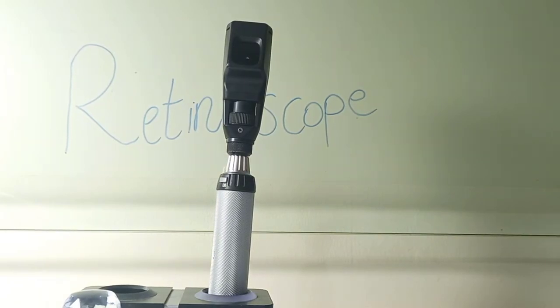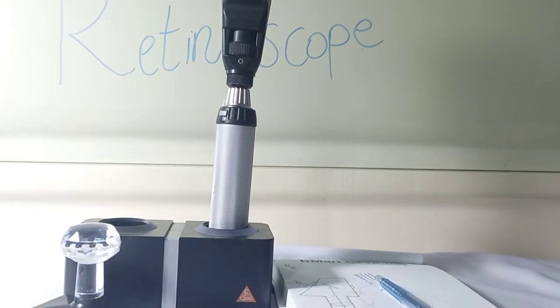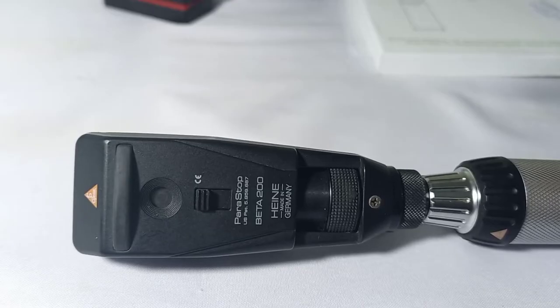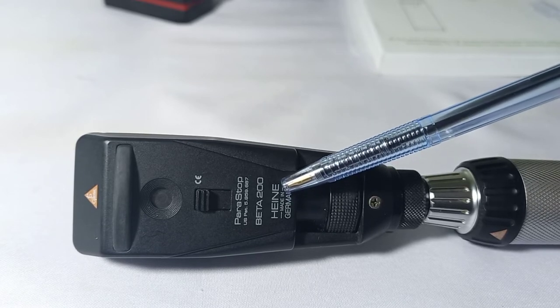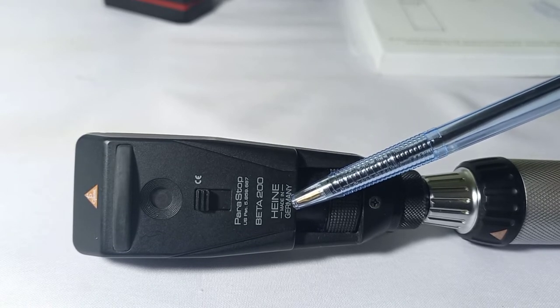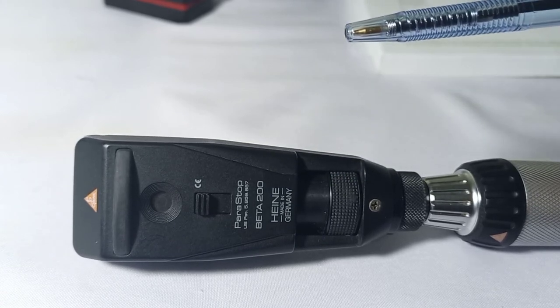In this video we will learn about the construction of the retinoscope and its different parts. We have the Heine retinoscope from Germany, model Beta 200, and we will learn about the different parts of the retinoscope.